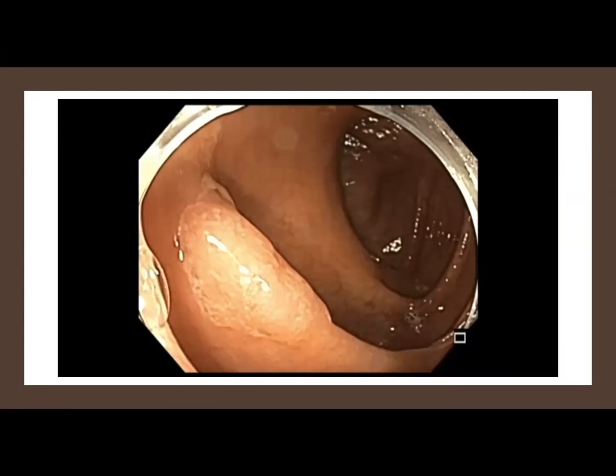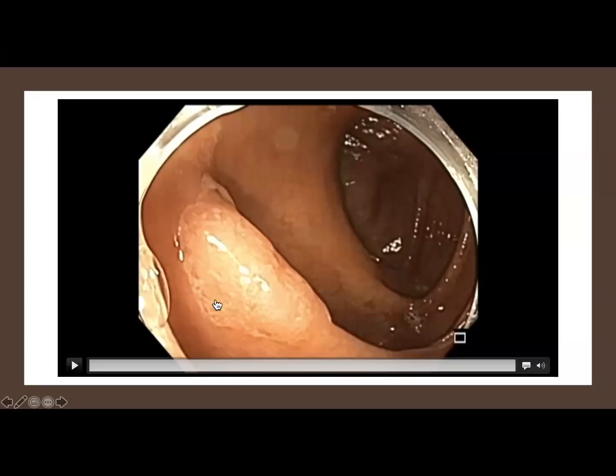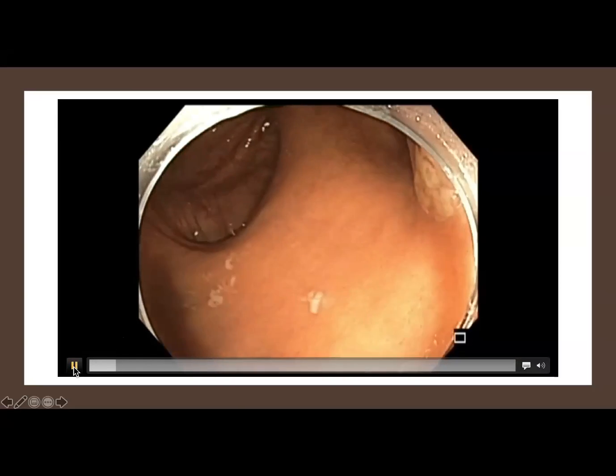Now, having said that, the dysplastic SSA sometimes could occur only in a few glands. So when you have like 3-4 crypts that are dysplastic, then the endoscopic feature is very hard to find. So those things I usually would miss, but the others I could predict. In this lesion, it's very interesting that on the surface, if you look closely, there is that star-looking area that could be a more depressed area. So I would be looking at that.